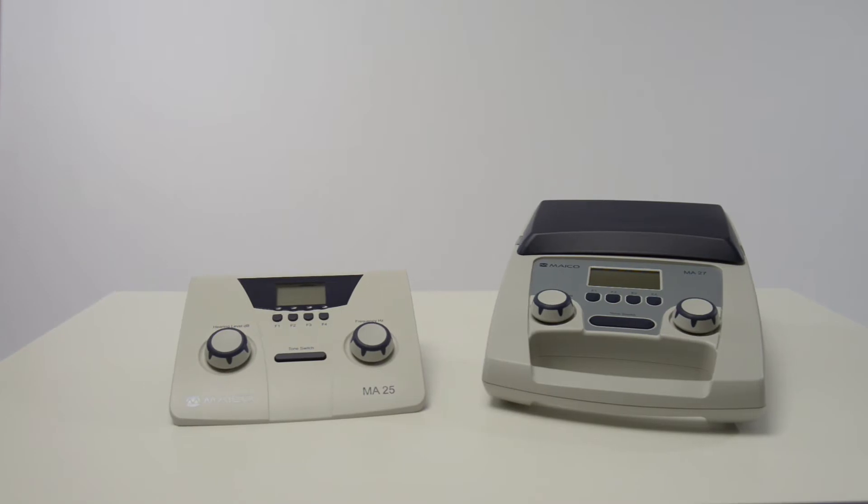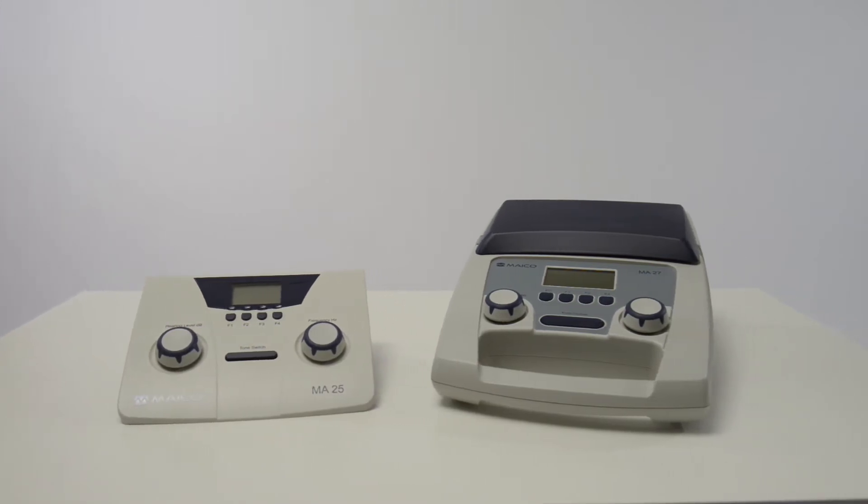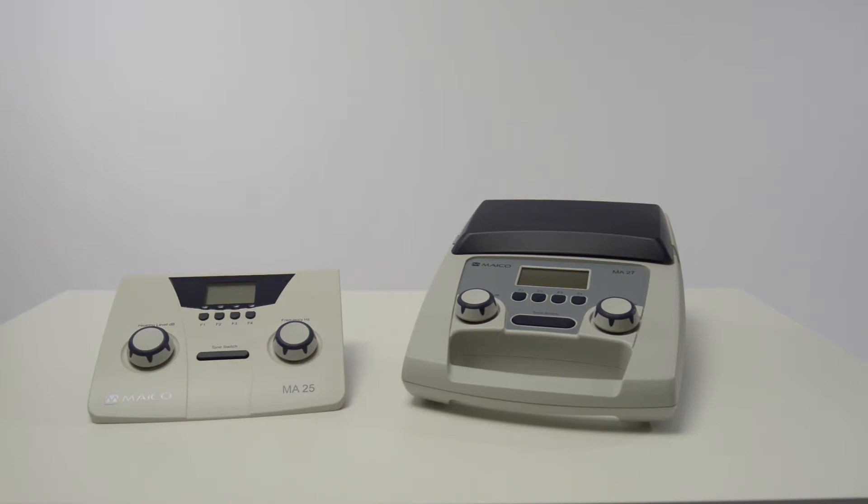This demo is to show you how to set up and use the Mako MA25 and MA27. The operation is the same on both units.